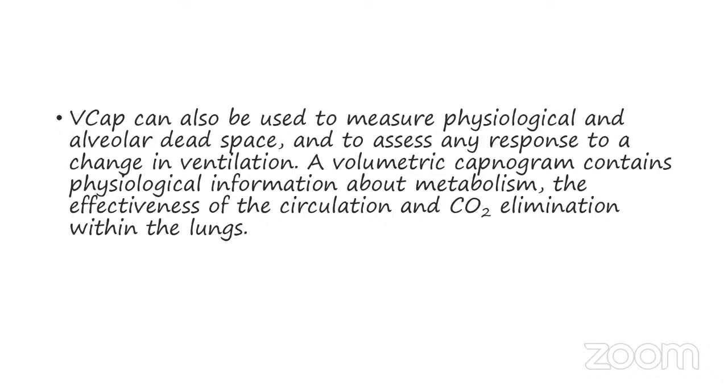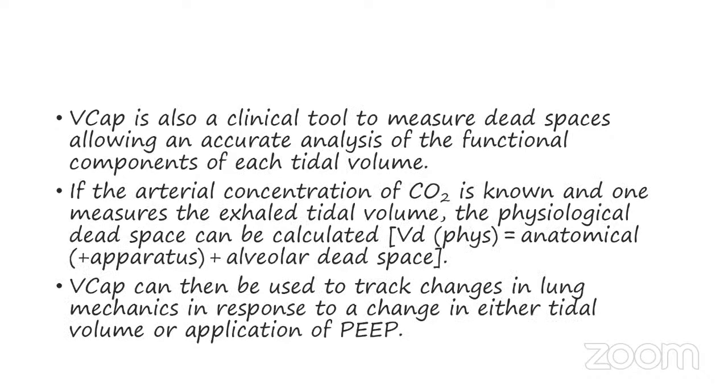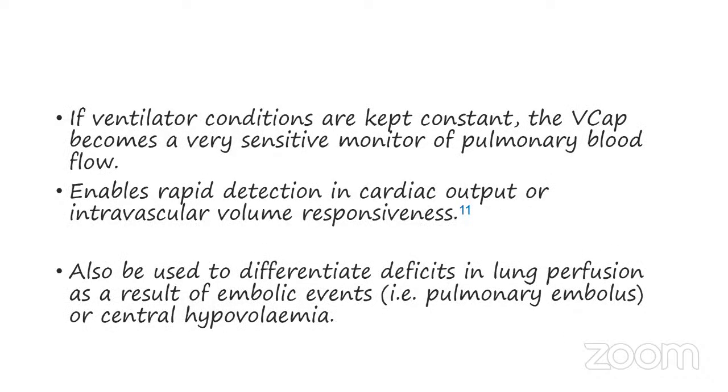Volumetric capnography can also be used to measure the physiological dead space and also assess any response to change in the ventilation. A volumetric capnogram contains physiological information about, again, the metabolism that I told, oxygen consumption and the carbon dioxide within the lungs. It is also a clinical tool to measure the dead space. It also helps to see the change in either the tidal volume or the application of PEEP. Even the pulmonary blood flow can be measured through this.